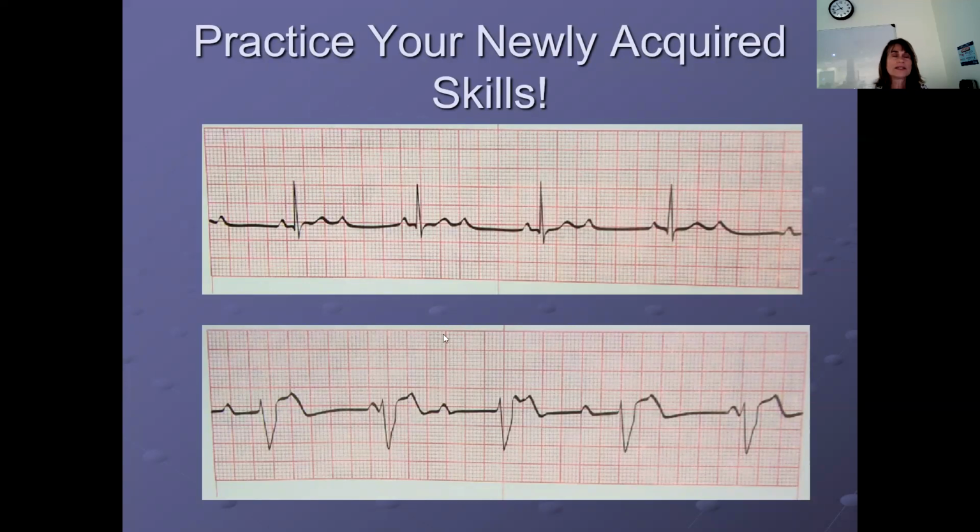Are they always down? It feels like they are. Yeah, because I'm confused, because if it starts from the ventricles, wouldn't it always be a downward deflection? So downward deflections can happen when you have your positive lead away from the left ventricle. So if you have a positive lead over on the right side of the body, you're going to get a downward deflection. Okay. So you can't say all downward deflections are complete heart block.